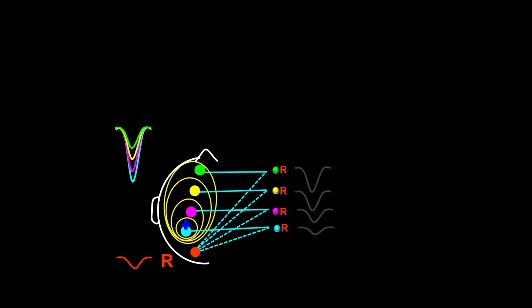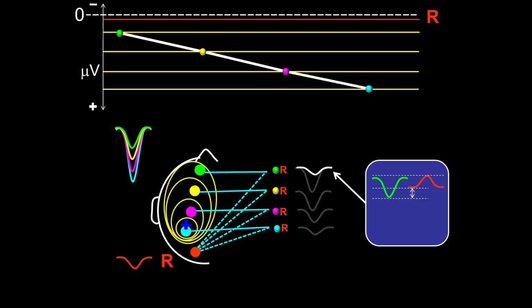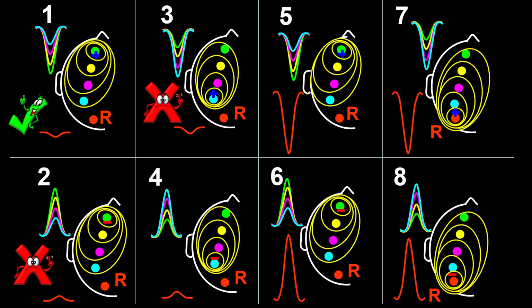In this frame, I am representing the corresponding isopotential map, the corresponding wave, and in gray by the side, the waves in question. Now I have added the corresponding voltage graph, and in this frame, I have introduced the blue square and the waves that will result from the function of the differential amplifier. So option 3 is not a sound option. Next, we should consider option 4.